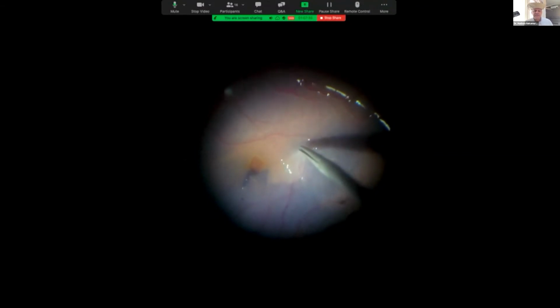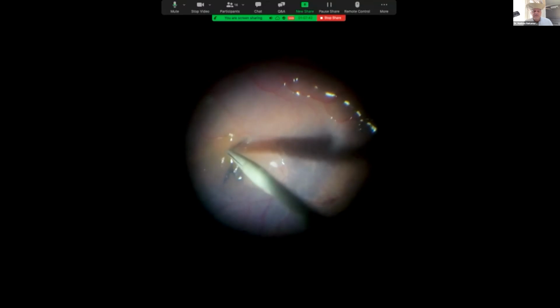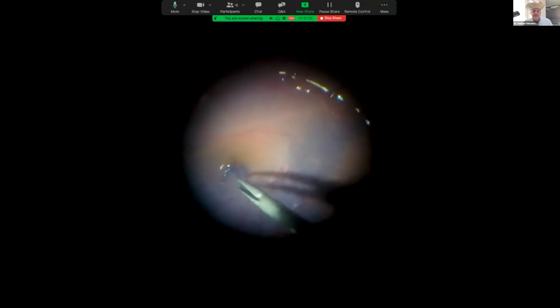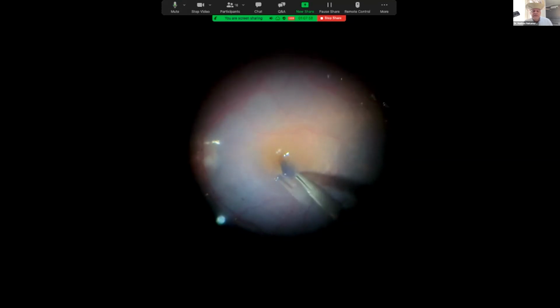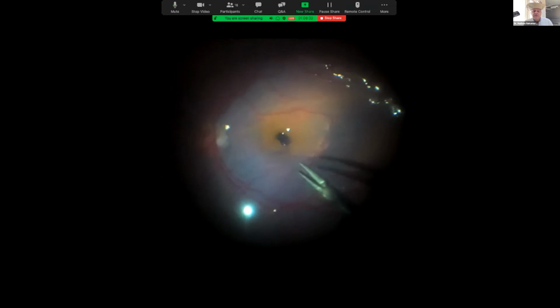So I get the internal limiting membrane above, and then you see that the perfluorocarbon liquid weighs on the retina. So if it escapes, you get the same part of the ILM. I make a round movement, and actually the edges meet each other at that place. And I put, as you see here, very superficial. I'm not dipping towards the RPE. So I get this and stuff it in an inverted fashion just underneath the hole there. And you see by transparency on the left side where this actually is, and you see the stalk is holding the stuffed ILM in place, in that way avoiding it from coming out, and also the perfluorocarbon is plugging that hole.